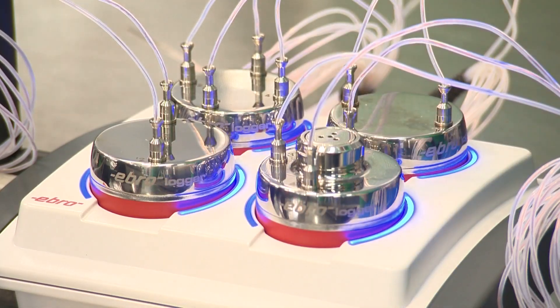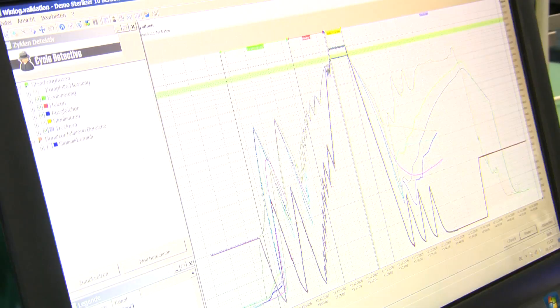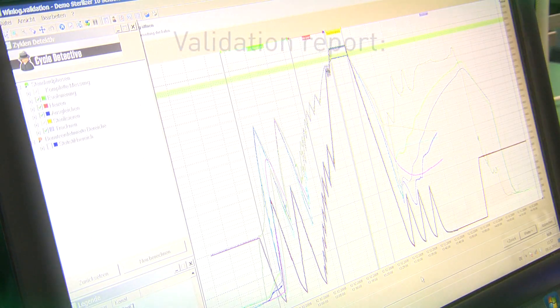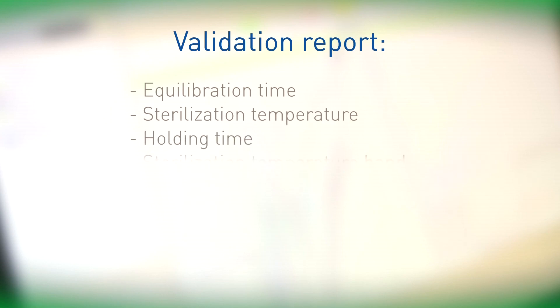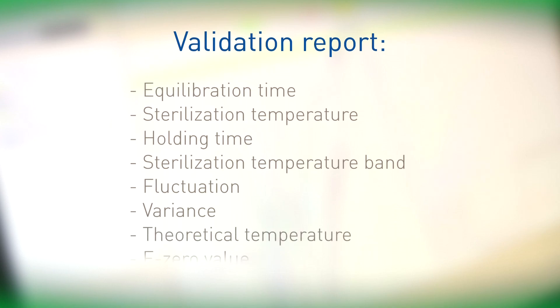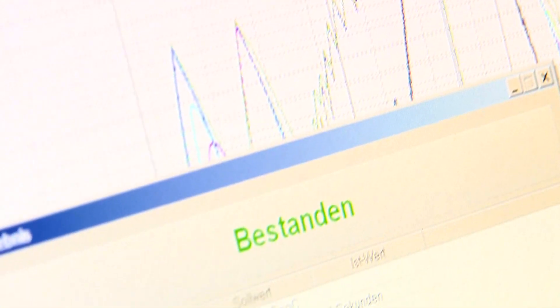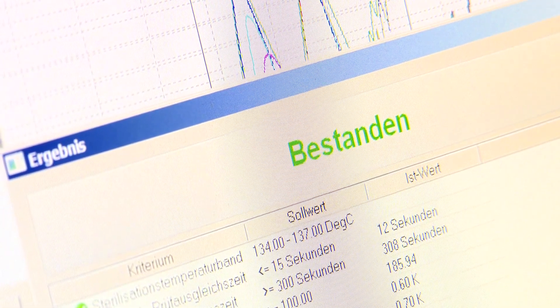After the measurement, the program automatically produces the validation report. The validation report specifies the equilibration time, the sterilization temperature, holding time, the sterilization temperature band, the fluctuation, the variance, the theoretical temperature, and the F0 value. Following this, clearance is issued by way of pass or not pass.